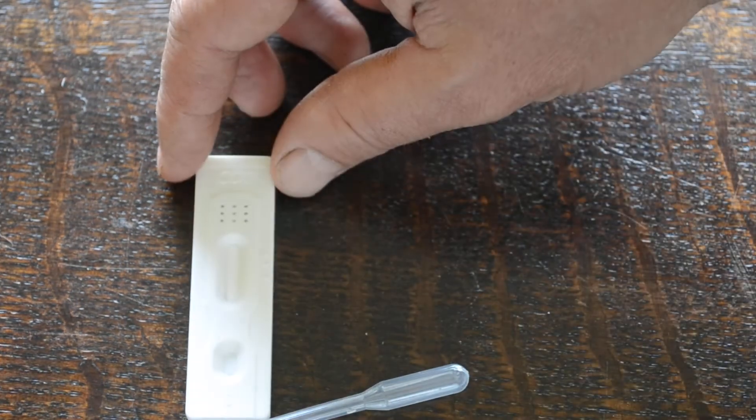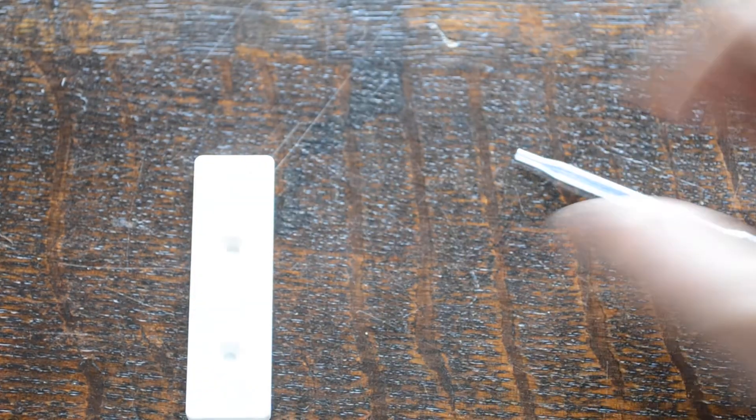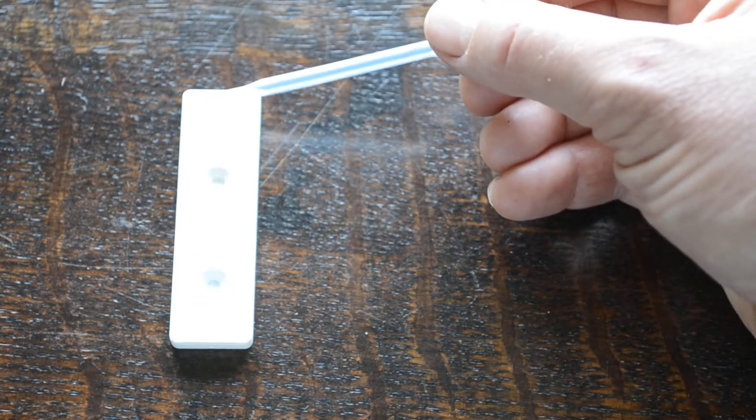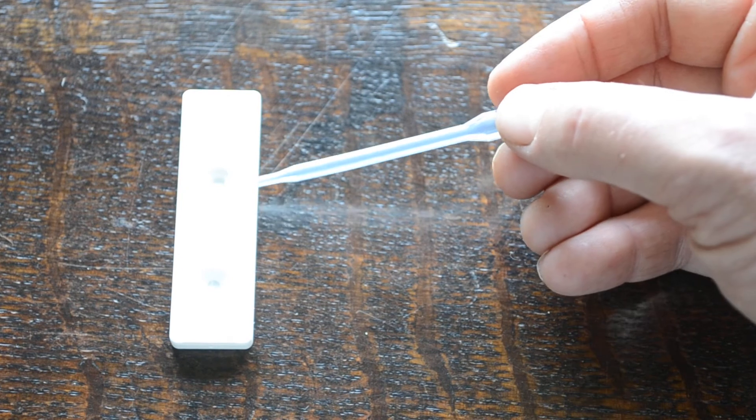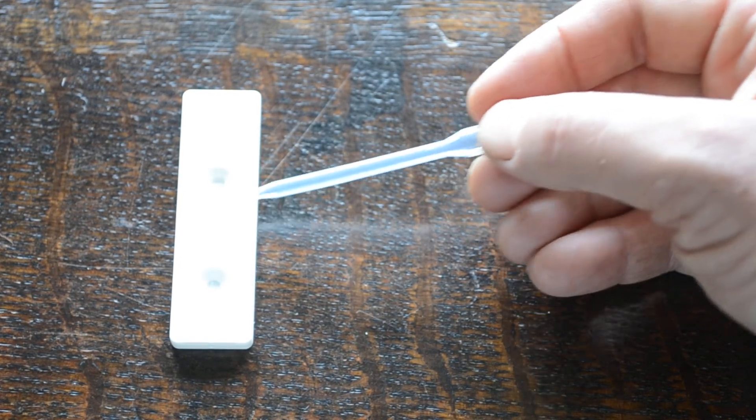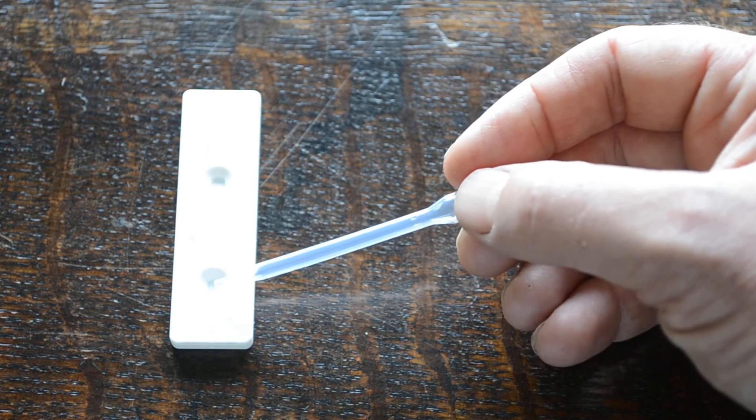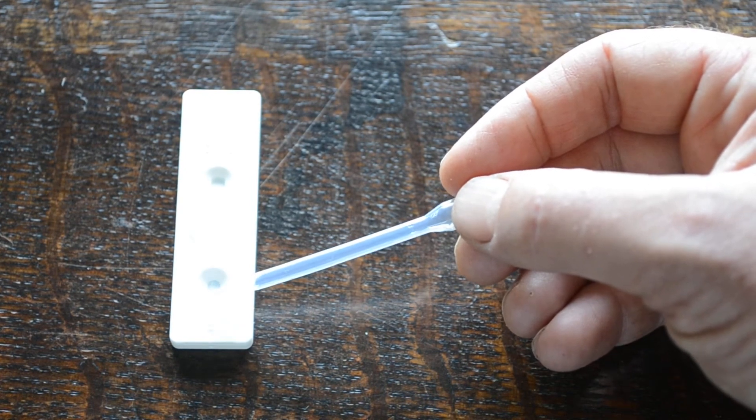And here you have the urine cassette for cotinine. It's labeled on the top here as C-O-T for cotinine. You've got a C line here indicated for a control and the T line for the test, which is your results window. And the S or sample well here, which is where the sample is applied.